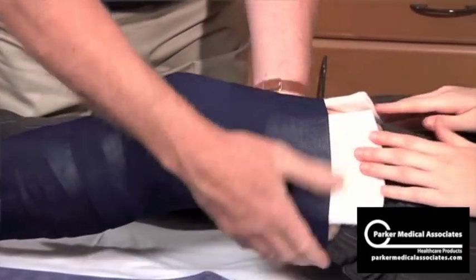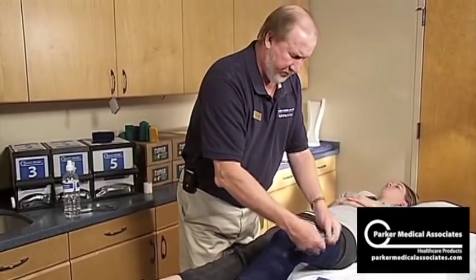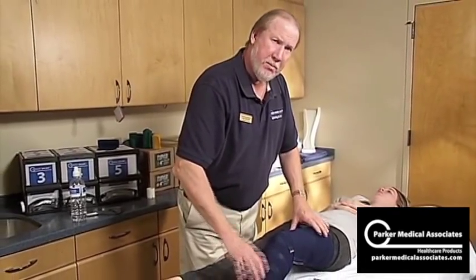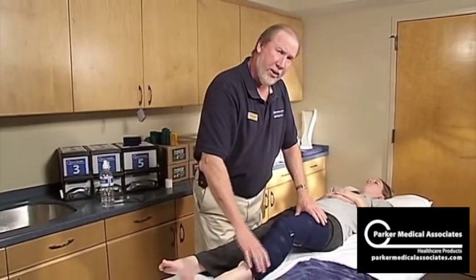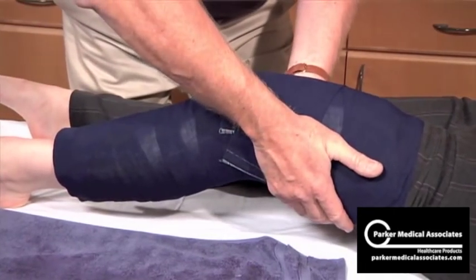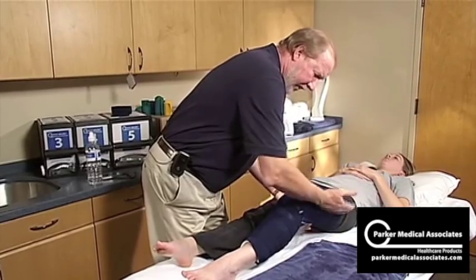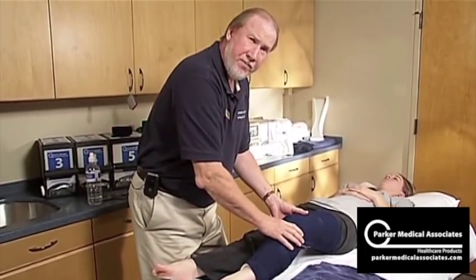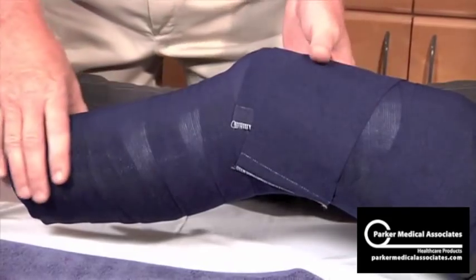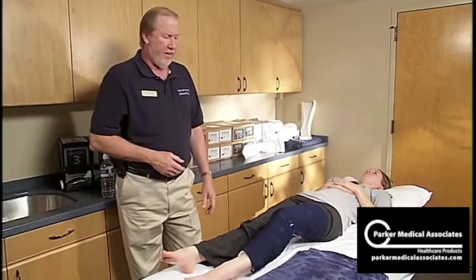You have a much lower profile. A lot of folks put knee immobilizers on over the patient's pants because they can't get their pants over that bulky knee immobilizer. This being so low profile, it goes on the patient's bare leg and the pants go back over it — so they don't have to take it off when they go home. You can mold a pocket splint; you can't mold foam — so you have a really nice fit. You can also put them into about 10 to 15 degrees of flexion, so when they walk out they'll have proper gait, as opposed to a straight leg where they tend to hit the floor. It's safer and more comfortable. And that's our knee immobilizer.